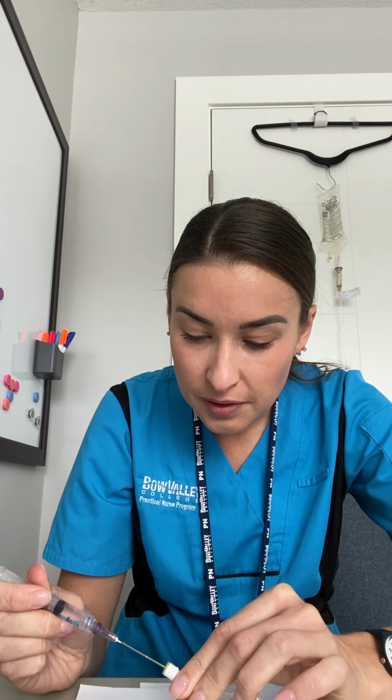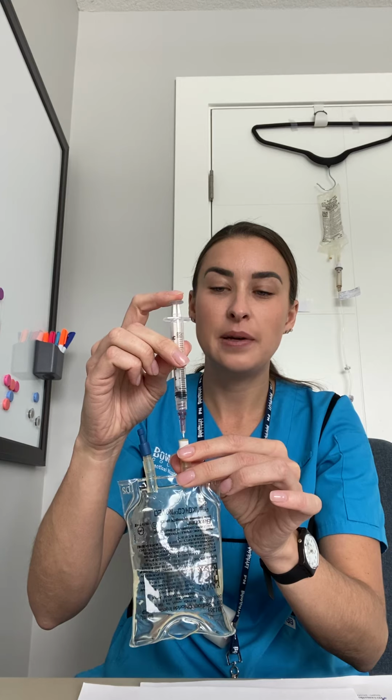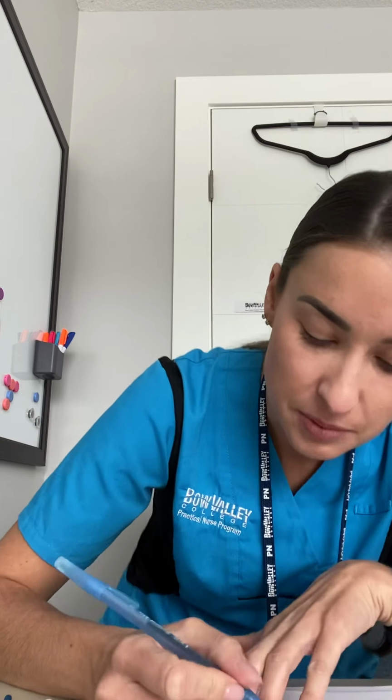Okay. So now we can inject the medication that we have here into the port that we have here, which we want to keep sterile. Okay, we want to insert all of the medication into the mini bag here. And we're just going to discard of this in the sharps container. So now that we have the medication in the bag here, what we want to do is write the medication label, okay? So we're going to write the medication label here.